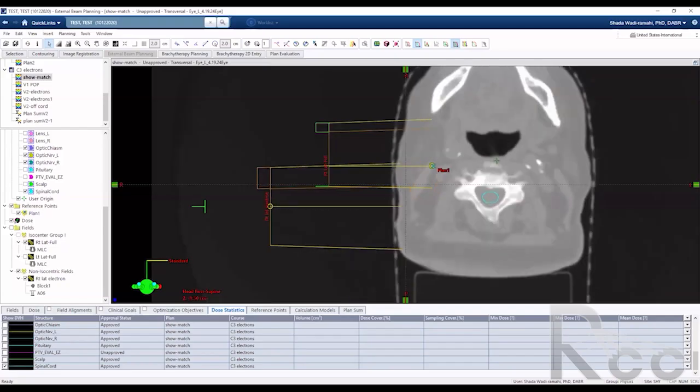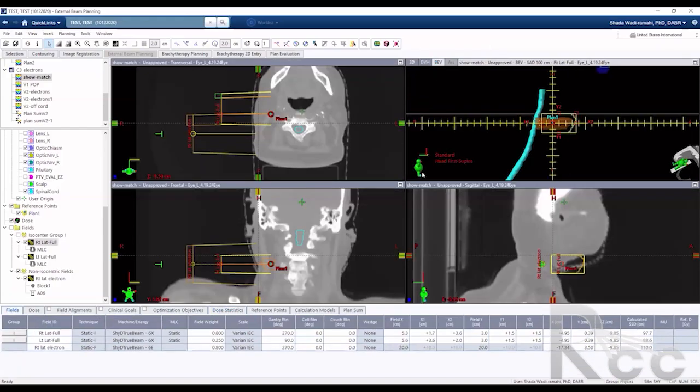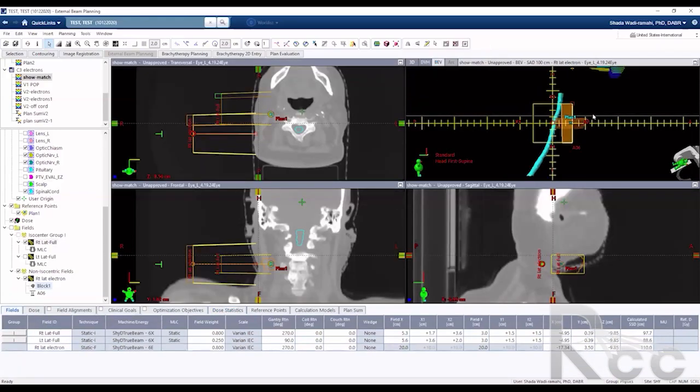And there are different ways of doing it. You could do it with your electron beam turned on. And then when you create the block, in this case, you can see this is the electron beam, upper right corner, and the block is the shaded color. And you start changing the block size. I could draw a larger block or a smaller block. And if I click here, this will change. So for the sake of illustration, you see how now it's changed. The orange is not meeting with the yellow. You see where my cursor is, right?